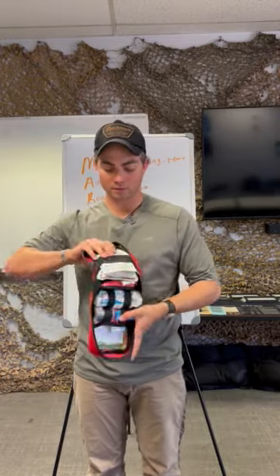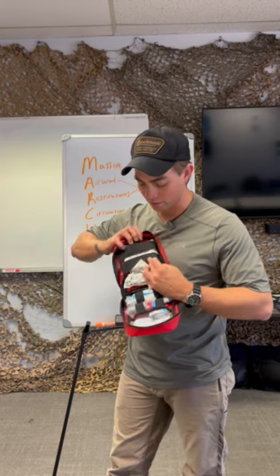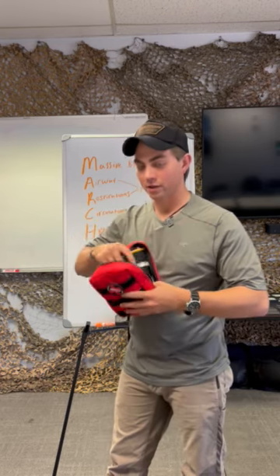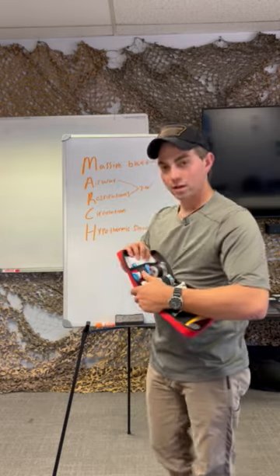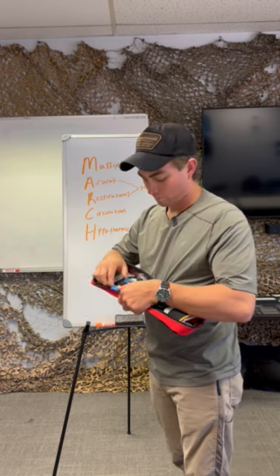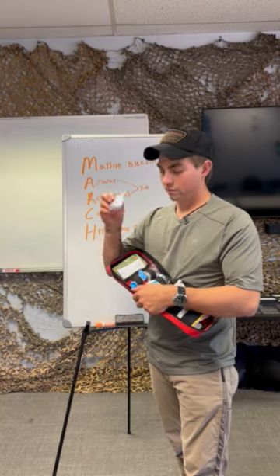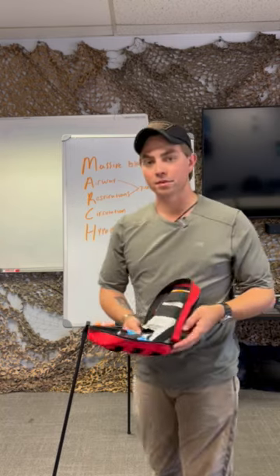Right behind that, I've got a wound packing kit of hemostatic gauze, roll gauze, and two pressure bandages, right? So again, more bleeding control tools, very easily accessible. Next, we've got our airway problems. So a good Halo chest seal, some PPE, some tape to secure everything, and an emergency blanket to start to manage some symptoms of hypothermic shock.